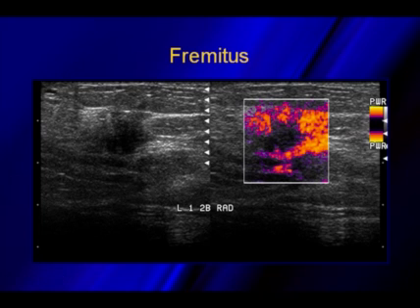But this is a case we kind of stumbled on. There's just a lot of things that you do in your practice. This patient had been called back because they saw a suspicious area on her mammogram. She came in, I did her initial ultrasound, took all the pictures, all the measurements. Our radiologist came back in the room to remeasure and take another look and explain to the patient what we'd found. And he was looking for the presence of blood flow inside the lesion with power Doppler.